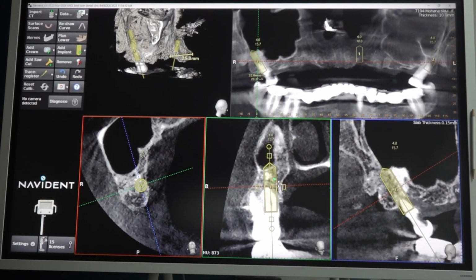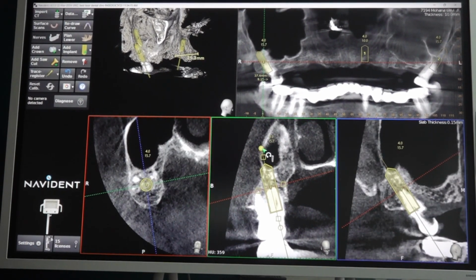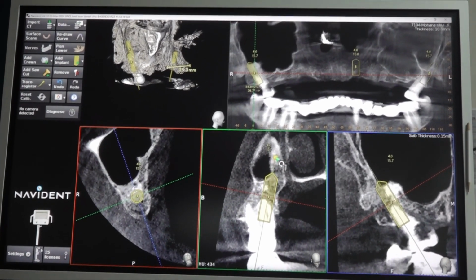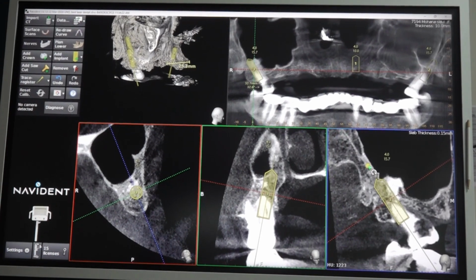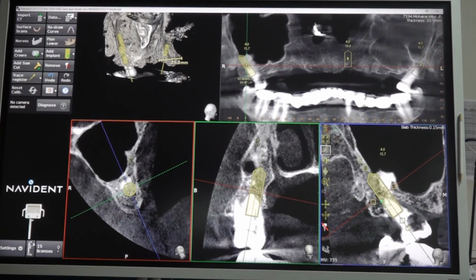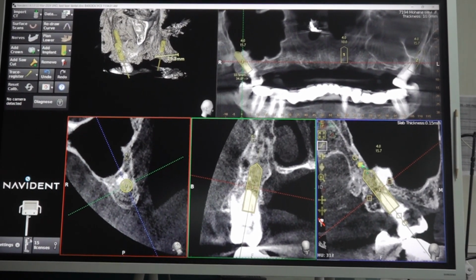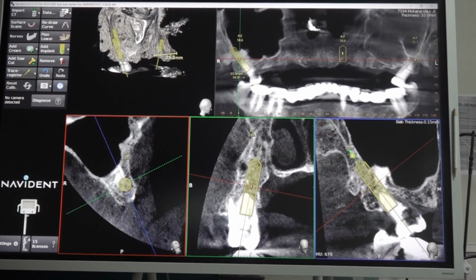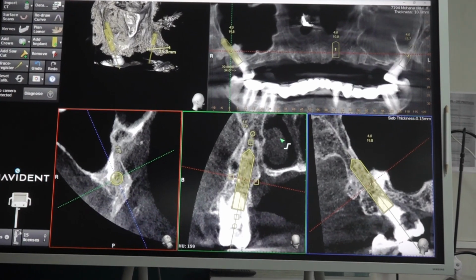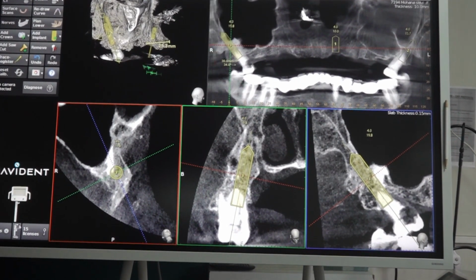Here if you see, the root angulation is going towards the buccal aspect. So we have to tilt it towards the medial aspect. Okay. So here also you are taking the socket as the guideline, but you are going slightly medially. And the angle is okay. Here also you can place a 4.2 by 16 or 18. It will be in this range only, 16 or 18. Okay, so 2 pterygoids done.